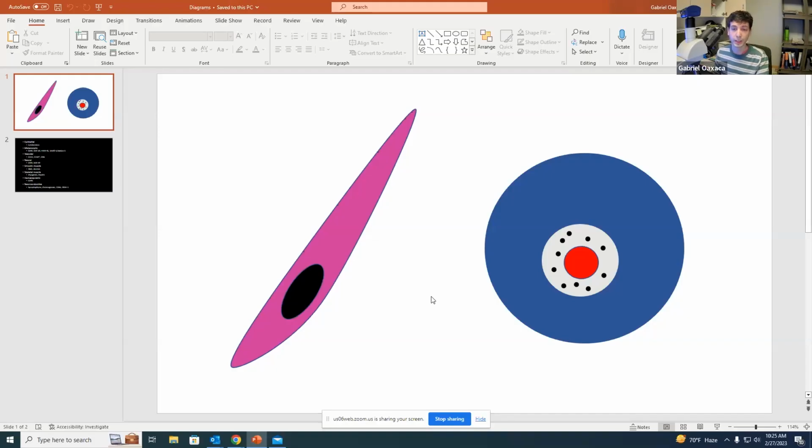All right, so we're going to be talking about spindled and epithelioid cells. Okay, so on our left, we have a spindled cell. Basically, they're elongated, as opposed to an epithelioid cell, which is recapitulating more like an epithelial cell, like cuboidal, squamous, columnar, something to that effect, and looks more like epithelial lining, but in fact is not.